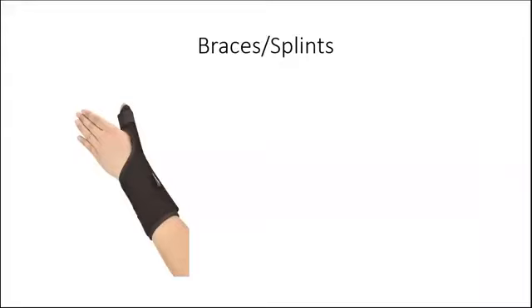One thing we need to mention here is this is a group of splints used for non-operative treatment that are stepped down from POP or casts or traction. Okay, in minor injuries, particularly soft tissue injuries or non-displaced fractures that are very stable, you still can use them primarily as definitive treatment to immobilize your fracture.